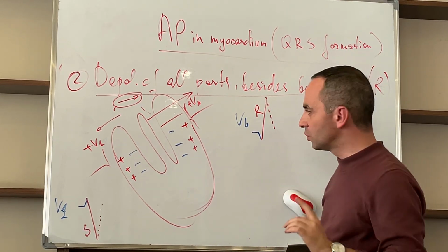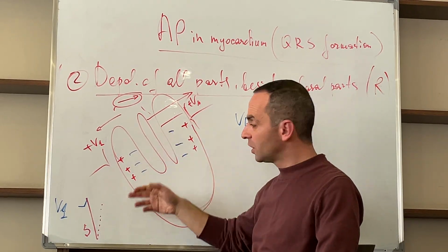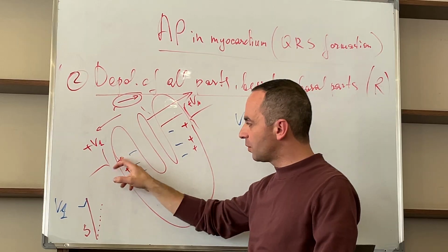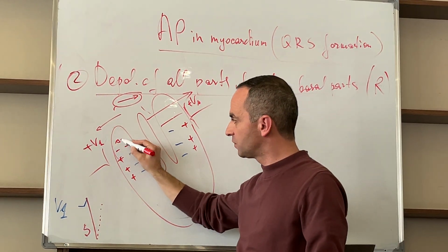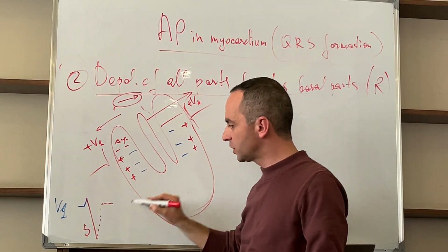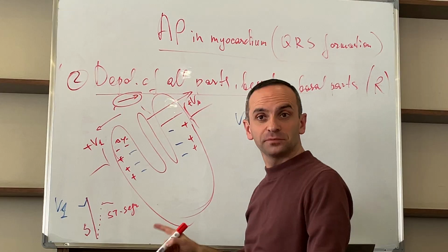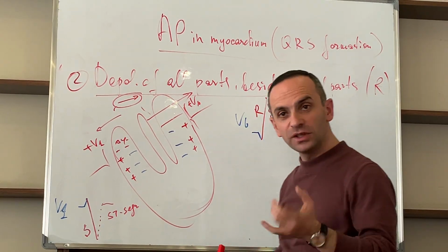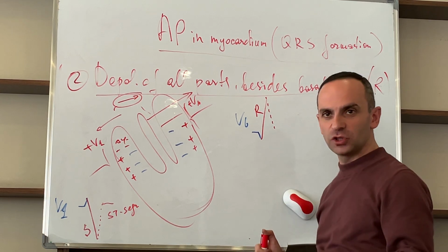Just going forward, look, for these basal parts, it mainly concerns the left ventricle. For the right ventricle, this will become minus, minus, minus, minus. So if everything is minus, delta phi is 0, and we'll have an isoelectric line. It is ST segment formation. But for V6, we need to have S. I'll explain. Then ST segment formation.